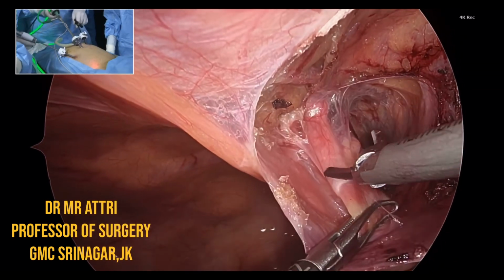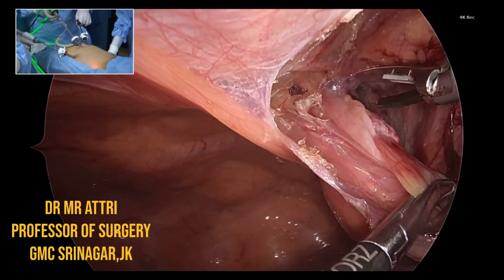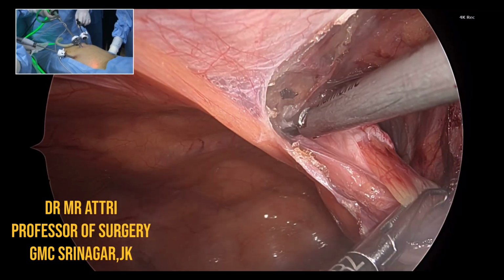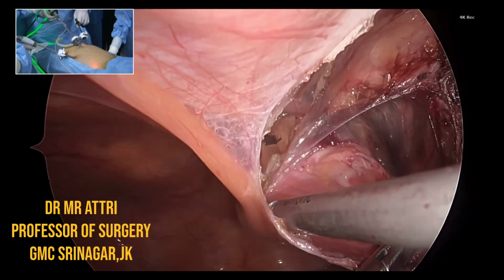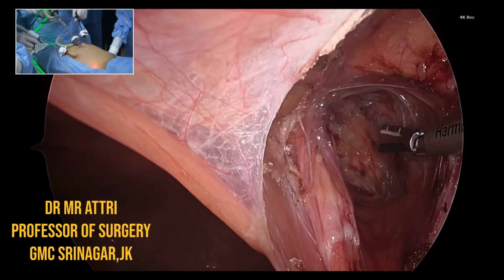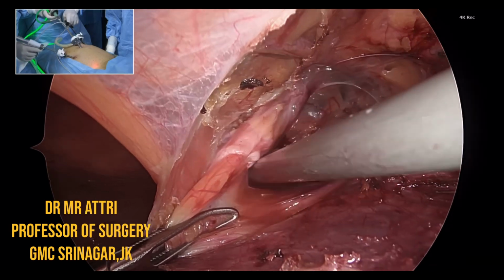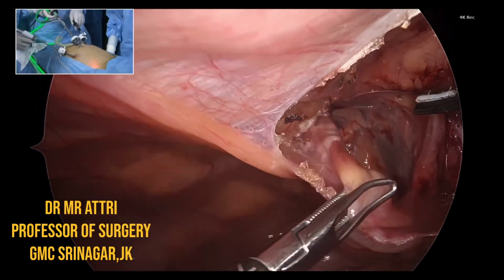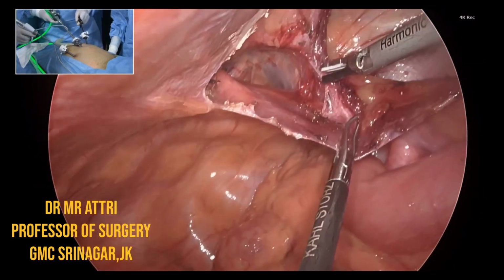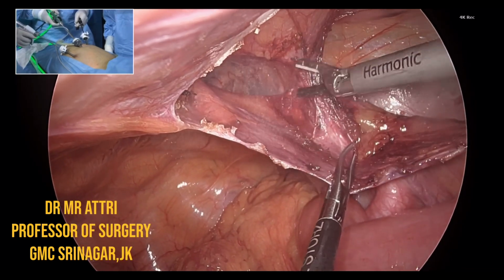So if I can show you the entire abdomen, that is the head end of the patient. And this is the xiphisternum, and you can see it's a very small abdomen, right? It's a 70-year-old lady, just about 4 feet 10 inches in height, and it is a small abdomen. I have marked out the costal margins on both sides, and we have a roll or a bolster below the right flank, so the right side is raised slightly, by just 20 degrees.